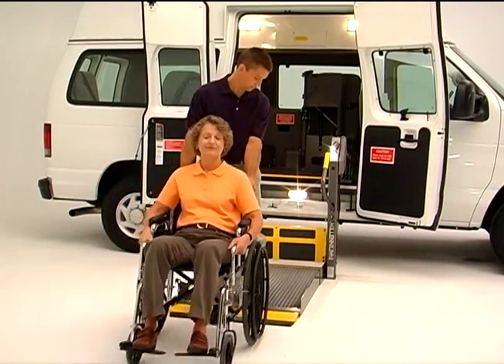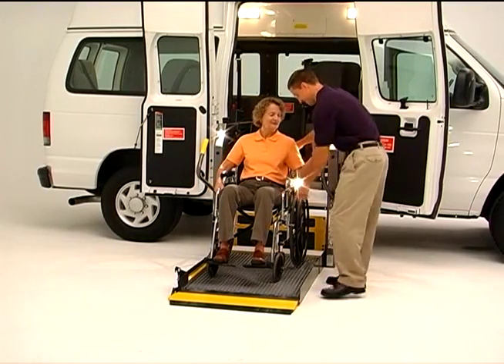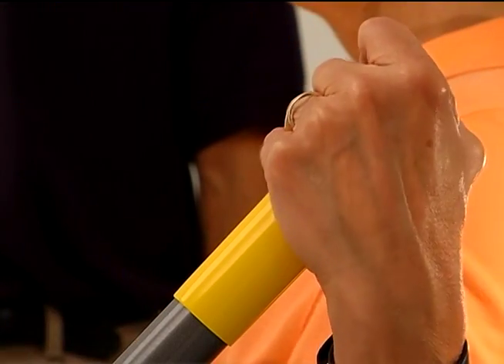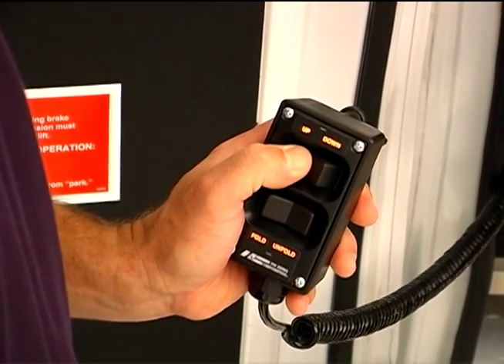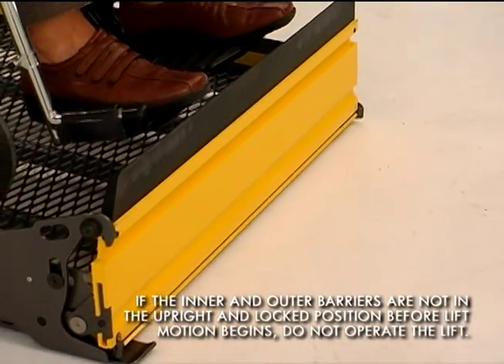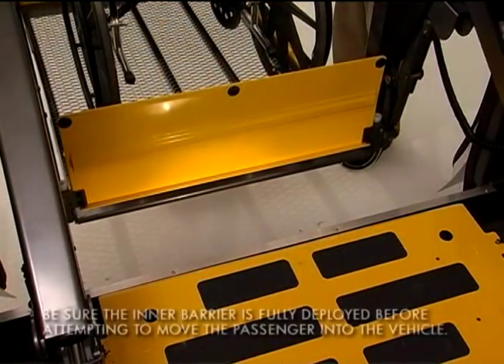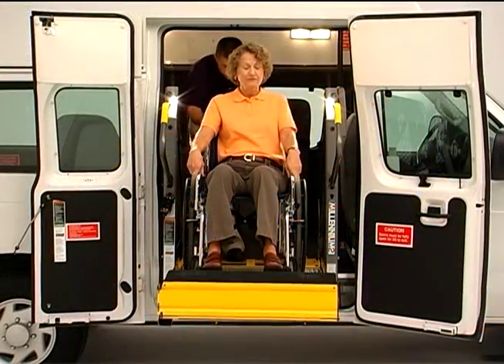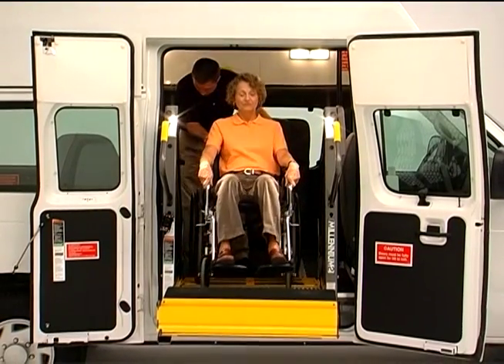To load a passenger, start with the platform at ground level and the outer barrier fully extended. Move the passenger onto the lift platform and into position within the yellow boundaries. Again, lock the wheelchair brakes, turn off wheelchair power on powered chairs, and have the passenger hold the lift's handrails if possible for additional support. While being sure to stand clear of the lift, press and hold the up switch on the pendant control. This will allow the outer barrier to move to the upright and locked position, and the platform to rise to vehicle floor level. The lift will stop at floor level automatically, and the inner barrier will move to the horizontal or bridging position. Once the lift has stopped completely, re-engage power to power chairs, disengage wheelchair brakes, and move the passenger into the vehicle compartment.